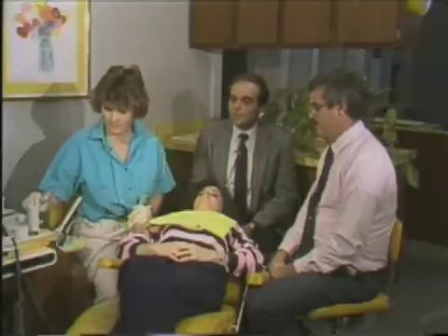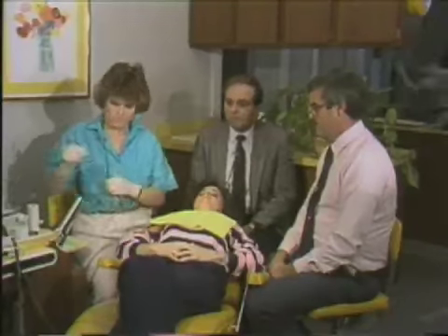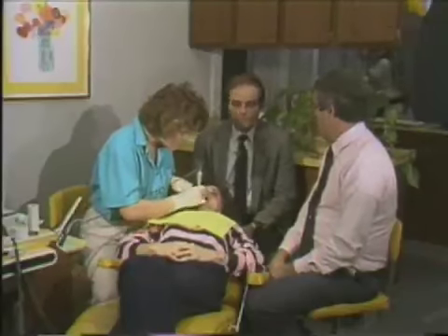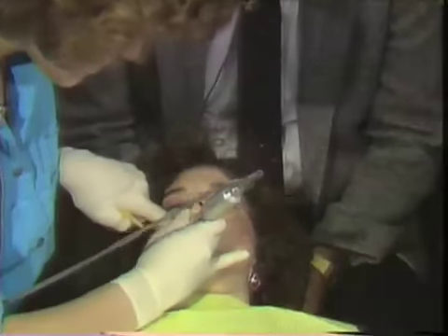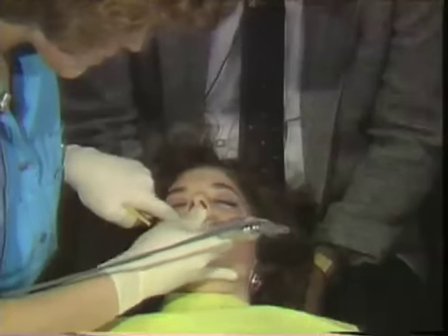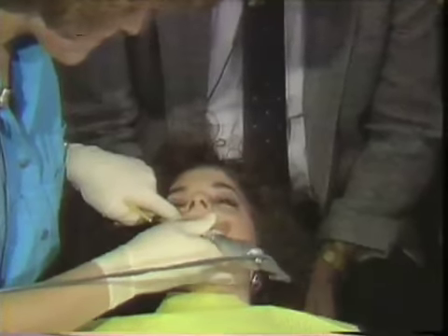The prophy is a critical step. It's kind of the initial cleansing before the acid etching, which is more of a deep cleansing. Prophy should always be done with a rotary instrument, utilizing a rubber cup or a brush. If there's a pellicle present, a brush would remove that. In this instance, the patient's hygiene is good. There is no pellicle present. Therefore, a rubber cup is satisfactory.